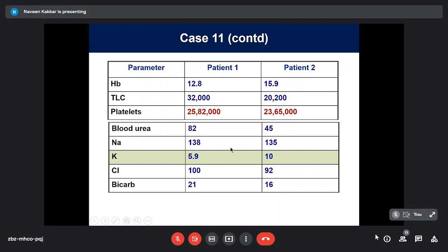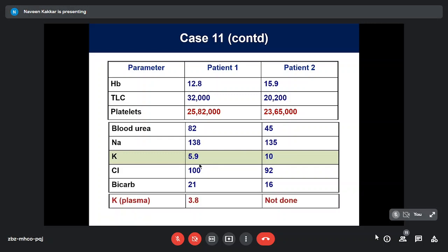That's the biochemical parameters. Here the potassium was hitting 6 almost, and the other patient was 10. Now we went to the ward just to have a look at the file, and he was sitting up on the bed. You can't be sitting up with a potassium of 10, and you will be in some trouble if you're hitting 6. So what was the problem here? We tried to sort this out with a plasma potassium. Remember, what we do always in biochemistry is a serum potassium. So we did a plasma potassium in the first patient. The potassium came down to 3.8, not 5.9. It's a huge difference. This patient refused a repeat sampling, so the potassium was not done. But we knew it was much lower than this because he was hale and hearty. 10 means no survival.